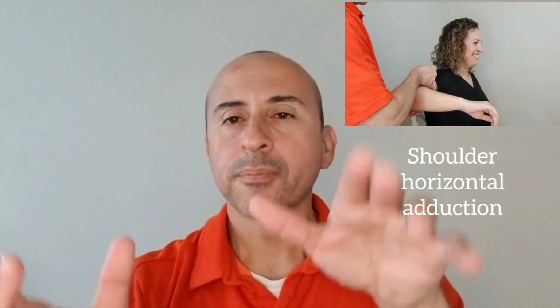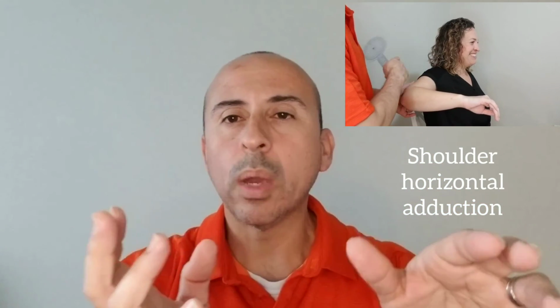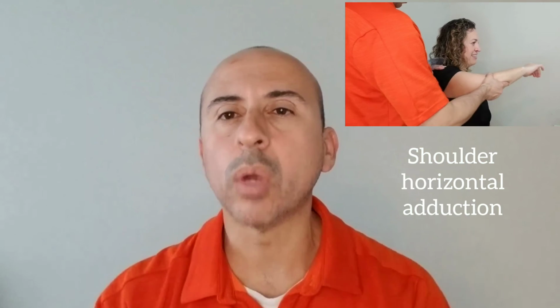And the other thing is just your hand placement. Remembering the basic concept that if you're doing some sort of manual muscle testing or goniometry, you're usually keeping your hands one point away or one point towards that joint. You're usually not crossing multiple joints.